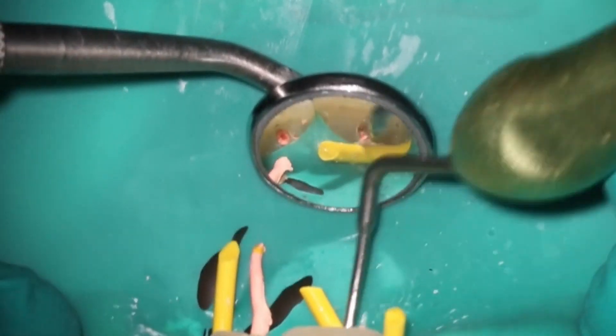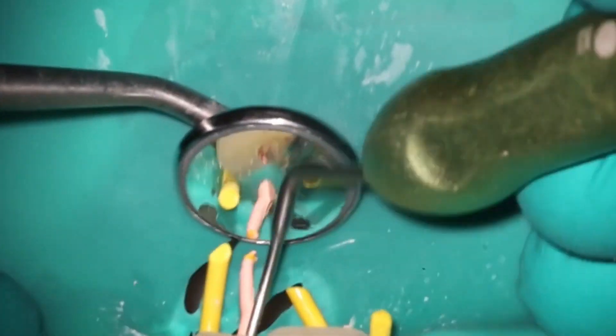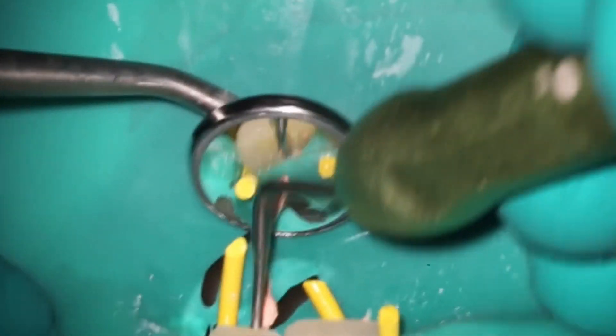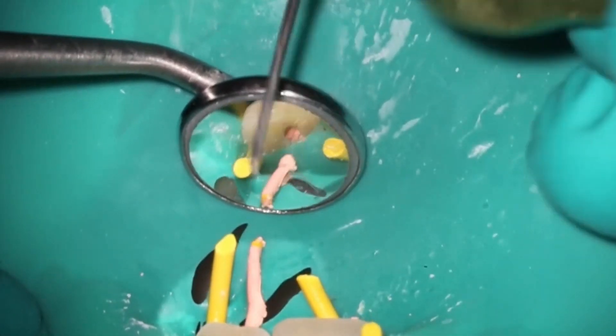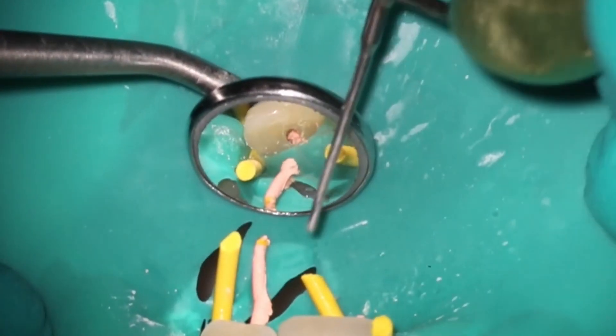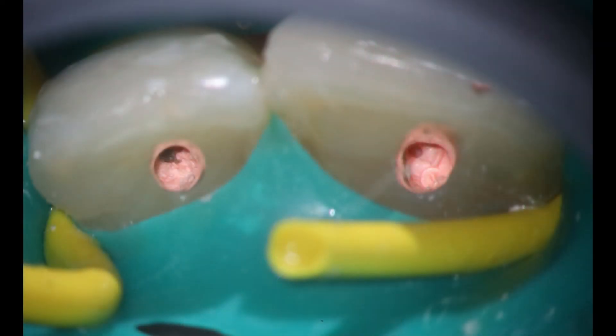The other thing I'm not going to do is use the endoactivator here. There's already an empty space at the apex — the apex is already quite large. You don't need to send that chainsaw flying down there and send a bunch of junk out of the apex of the tooth. That's not going to be a good day for anybody. Will it affect the long-term prognosis? Probably not at all, but not something you really want to send back with your name on it. I'm going to use the back end of the condenser here to create nice flat-looking spots. And there we are.